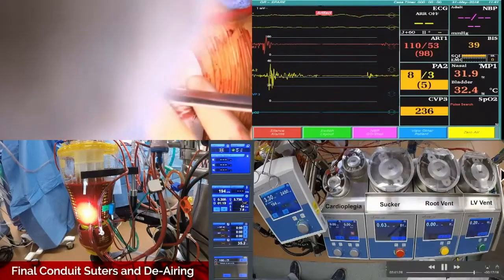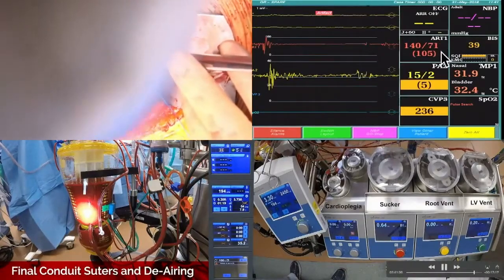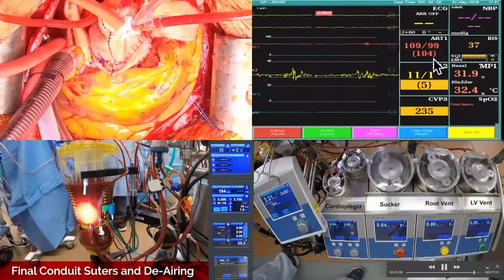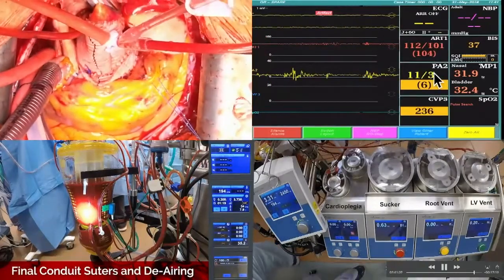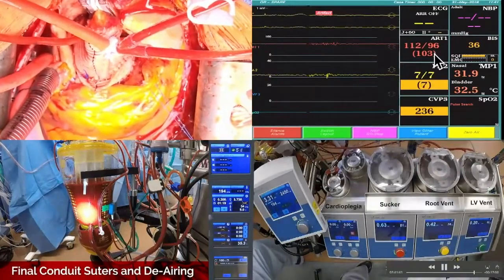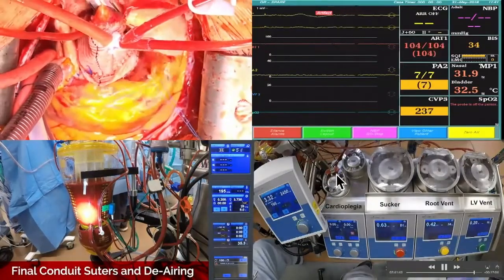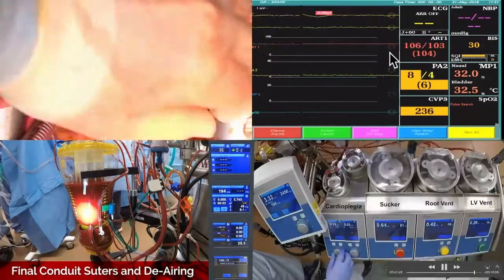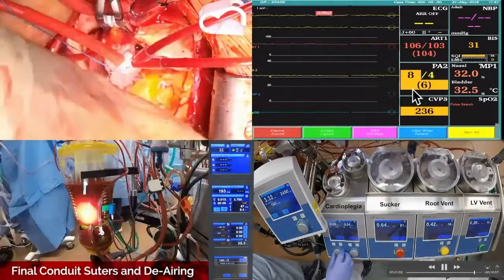Man, look at that blood pressure, Patrick. What are you doing? That's not me. The pressure's on. It's Mike. Yeah, over 71, something. That's not right. It's not pulsatile. What's wrong? They were drawing a blood gas or something. No, they weren't drawing a blood gas. Dude, you had a pulse pressure of like 50. Didn't you see it? It was like 110 over. Okay. That looks like a lot of Neo. That looks like Neo to me.